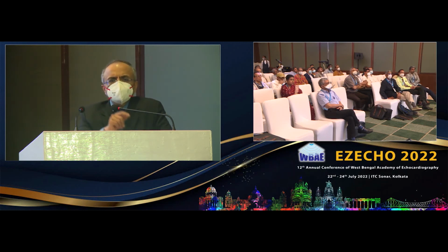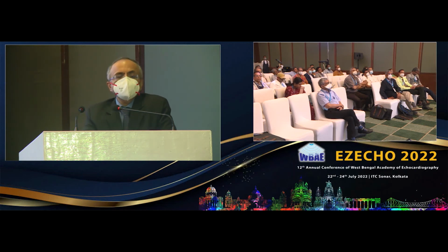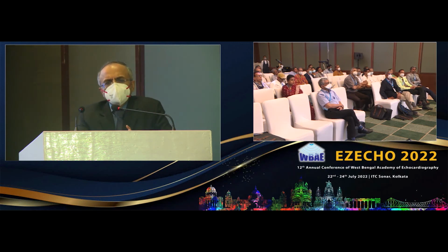Third thing is, most of these trainers, now luckily football is an aerobic activity, so they need to increase their stroke volume. So their LV dimensions are on the higher side. So any LV dimension going above 50 millimeters is very unlikely to be HCM, because in HCM, the hypertrophy is always at the expense of LV cavity. So they have a disproportionately large LA and a smaller LV, while the athletes have both LA and LV dilated, because they want to increase the stroke volume. Unless he's a weightlifter, there the question is different.